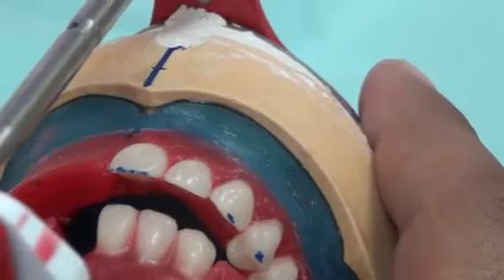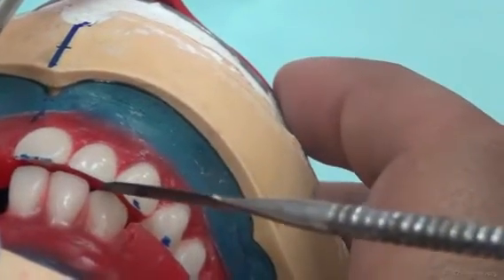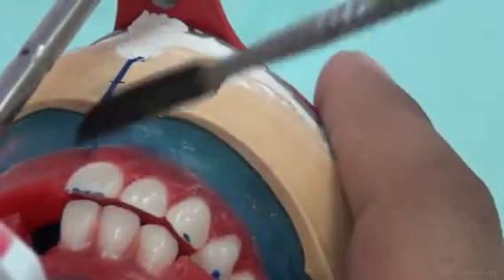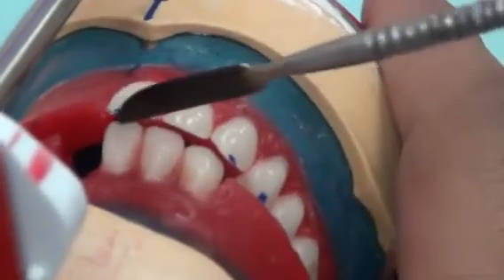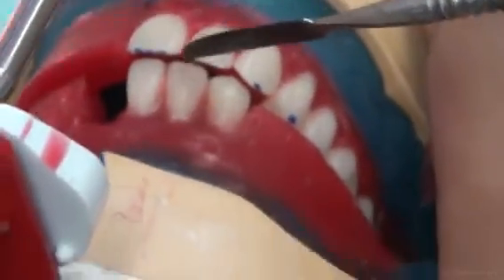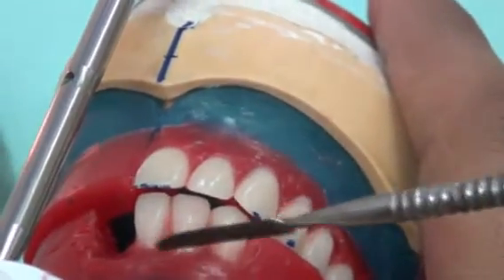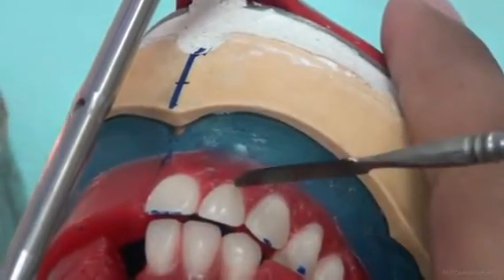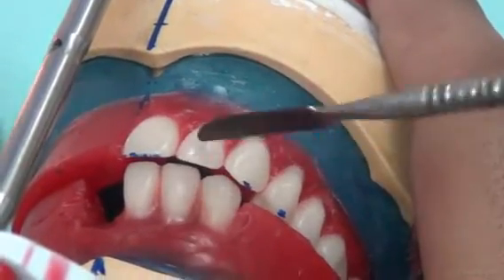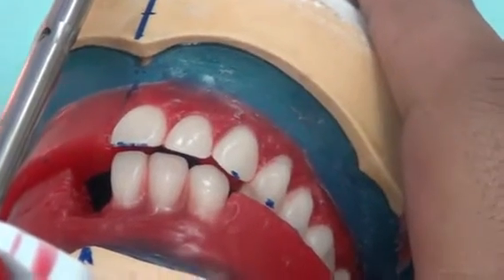And when we put the upper and the lower, we can see that the overjet, the space between the upper and the lower, are equal from the inside. Notice that the overbite that we had, which is 1 to 2 millimeters, is closing the space that we had beneath the lateral. Do you remember that the lateral was not on the occlusal table? So the amount of overbite of the lower has reduced and eliminated any space appearing between the two laterals. And you can see that the canine is located between the two laterals.